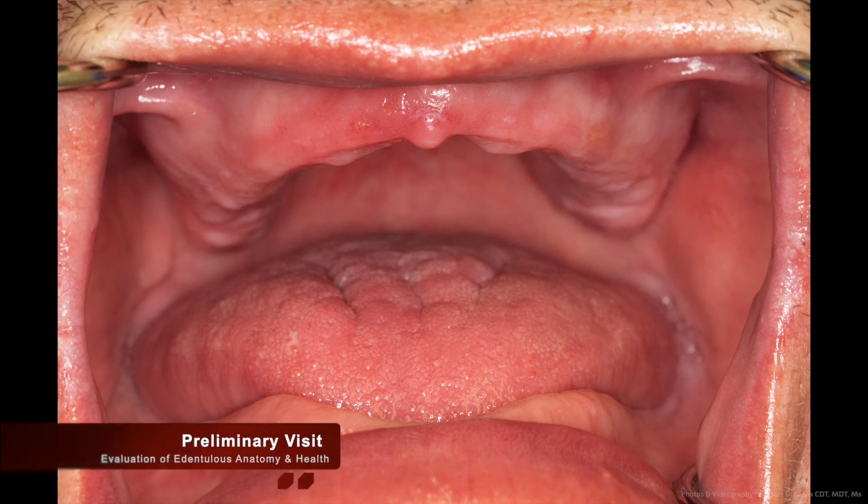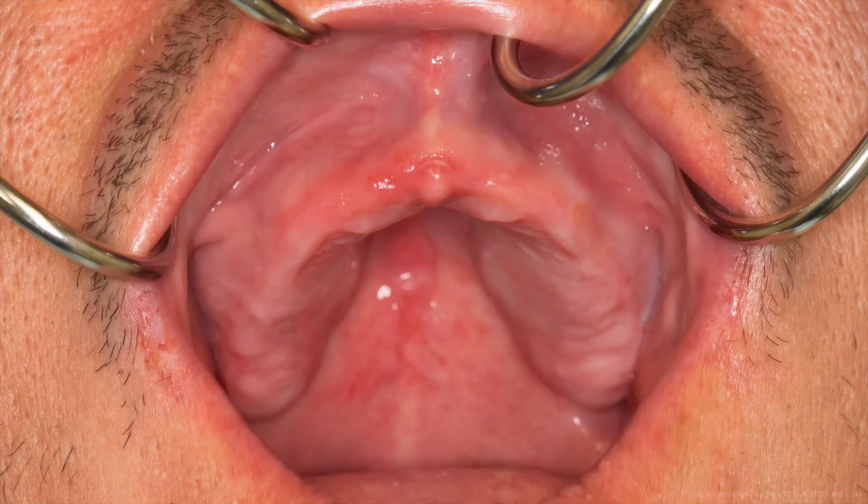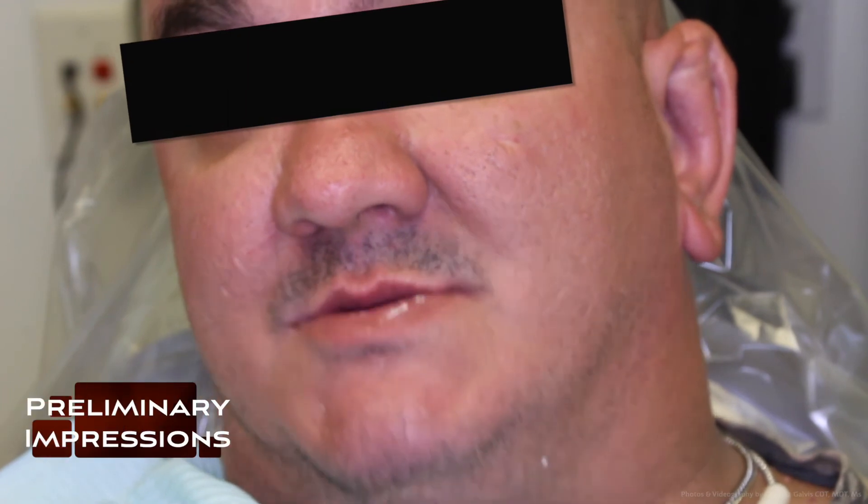Now that we have evaluated his complete dentures intraorally, it is time to take a look at what's underneath. Let's evaluate his edentulous anatomy and his oral health. Overall, to a dental technician, we are looking for his bone structures and whether there are anatomical landmarks that will aid in the retention of the denture. In this case, he has retained bone pretty well.